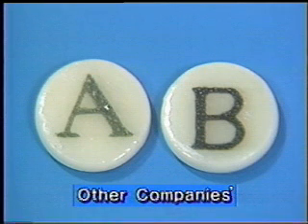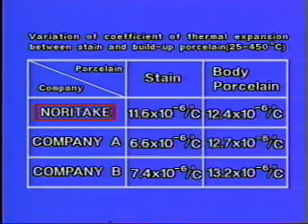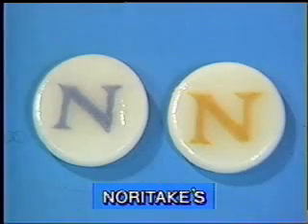The reason lies in the incompatibility of thermal expansion between the interface of stain and body or translucent layer. Thermal expansion of previous stain reaches only 1/2 of that of body or translucent porcelain. Therefore, a gap occurs between stain and body or translucent layer during porcelain baking, and this accounts for the porosities. Internal live stain shows approximately the same thermal expansion as that of body porcelain. Contrary to the above, no bubbles occur in the test pieces of internal live stain.